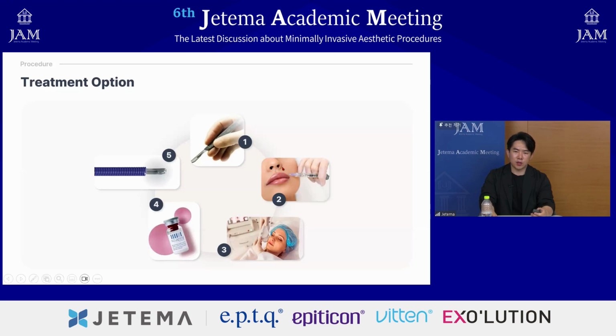So the second option they think about is filler. But if you use a lot of filler in the tear trough area, there might be a defect called the Tyndall effect, because the HA can reflect the sunlight and become a little bit bluish. And if there's too much filler inside, it might look a little bit puffy. The third option is the laser. There are a lot of lasers, such as HIFU, RF, CO2, plasma, but you cannot get a direct effect with the lasers.